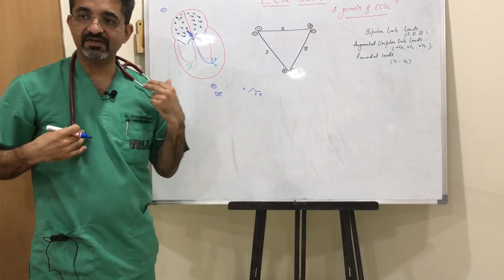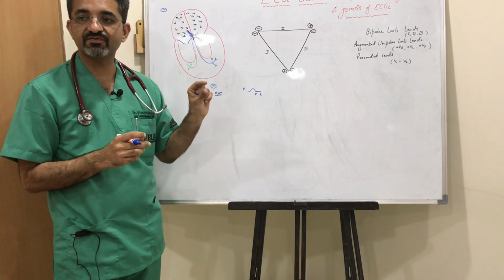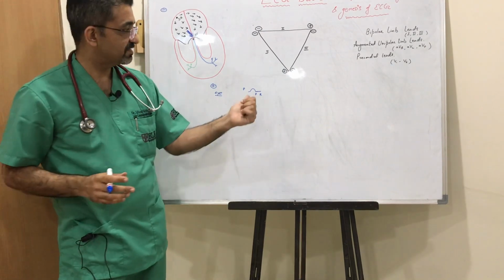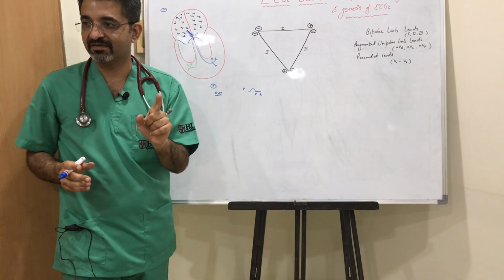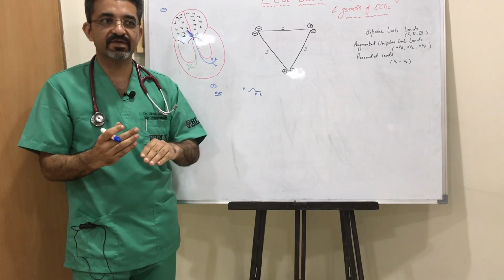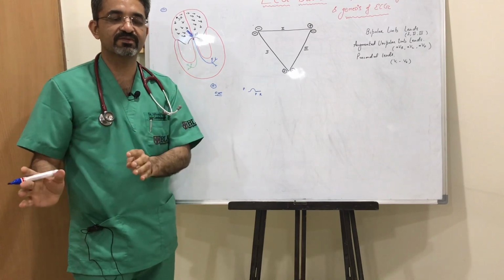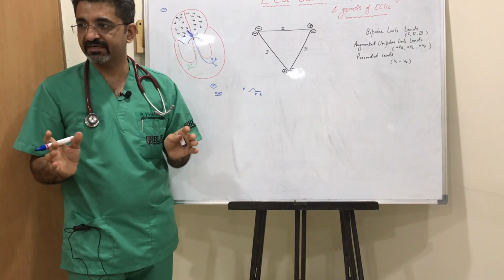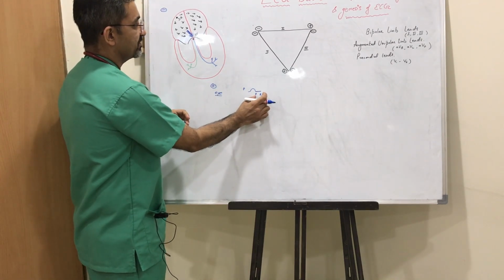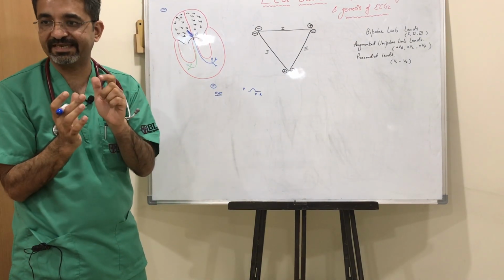In our subsequent lectures, we will understand the significance of the PR segment, but just to give a basic concept, the PR segment is very important to judge ischemia and infarction of the atria, because till PR, you don't have the ventricle involved. The electrical activity is still till the AV node. So whatever happens at PR, maybe it goes up or it goes down, it will tell you some pathology, some ischemia or some infarction of the atria, right? In which leads will come in the subsequent lectures. So you have a PR segment which is formed by the AV node holding the charge for about 0.1 second.